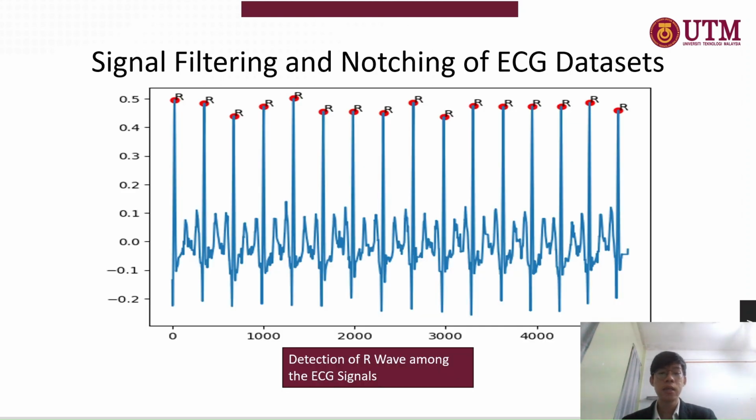And in this slide, it clearly shows that the R wave has been clearly detected, and it can be seen that the R wave is at the highest peak of a specific ECG dataset.